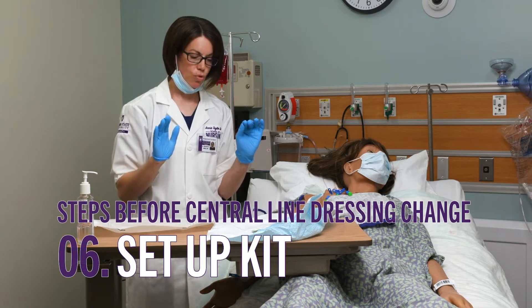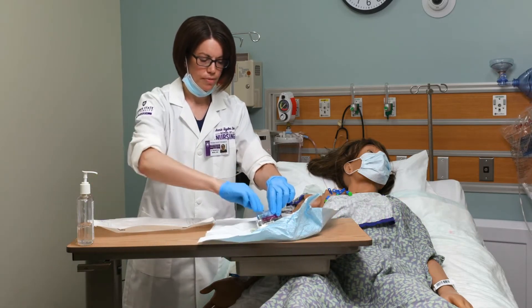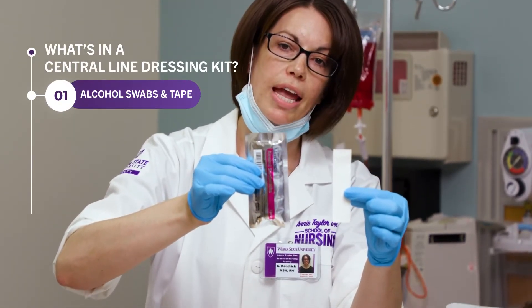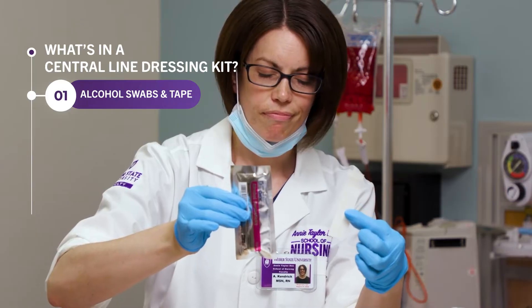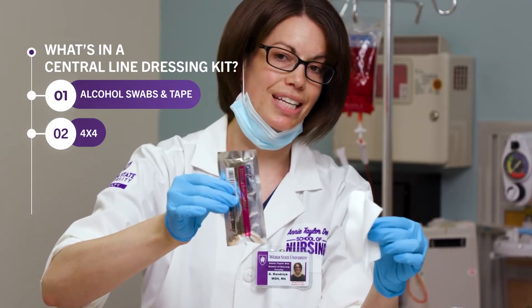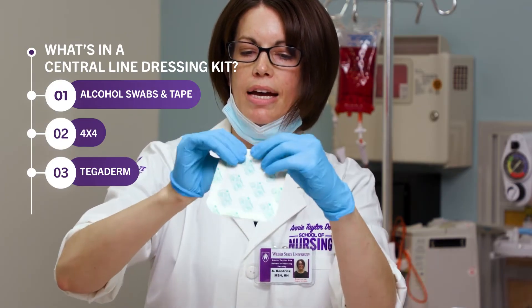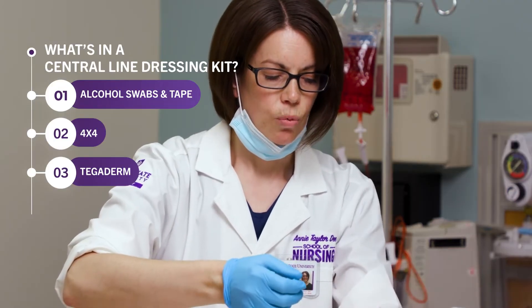Now I'm going to get my supplies set up. Inside the kit we have three alcohol swabs, a piece of tape to use at the end after placing the new Tegaderm to help make sure it's really secure, and a four-by-four that I can use to pick up the lumens to clean underneath while maintaining sterility. We also have a Tegaderm — I'm going to bend back the plastic piece to make it easier to grab later — and our chloroprep.